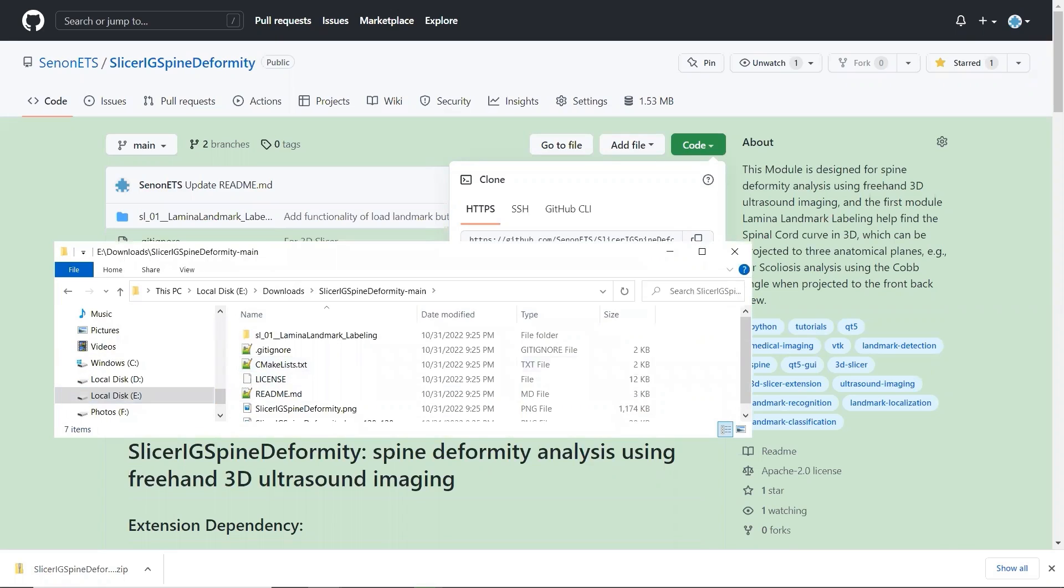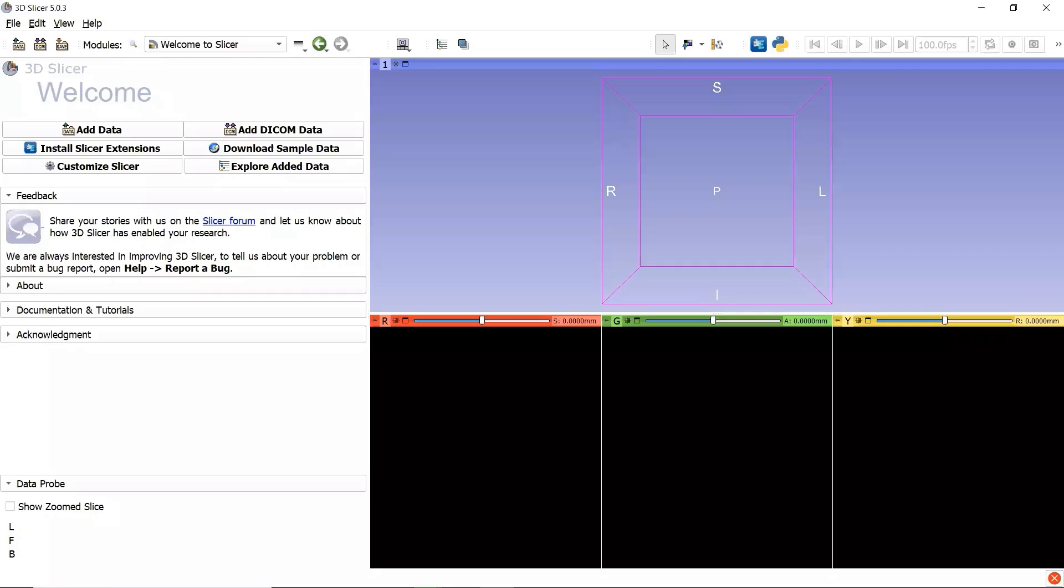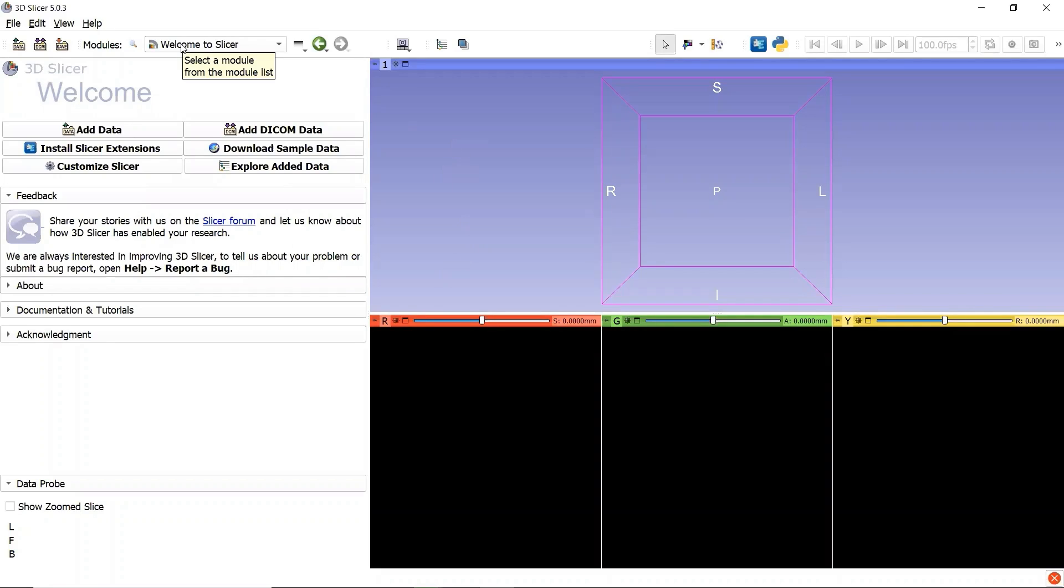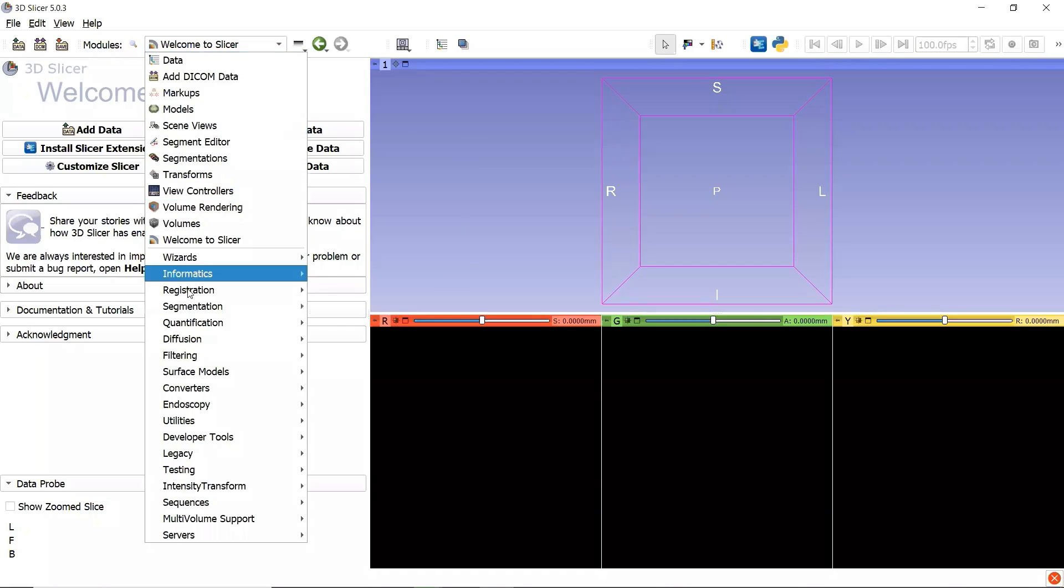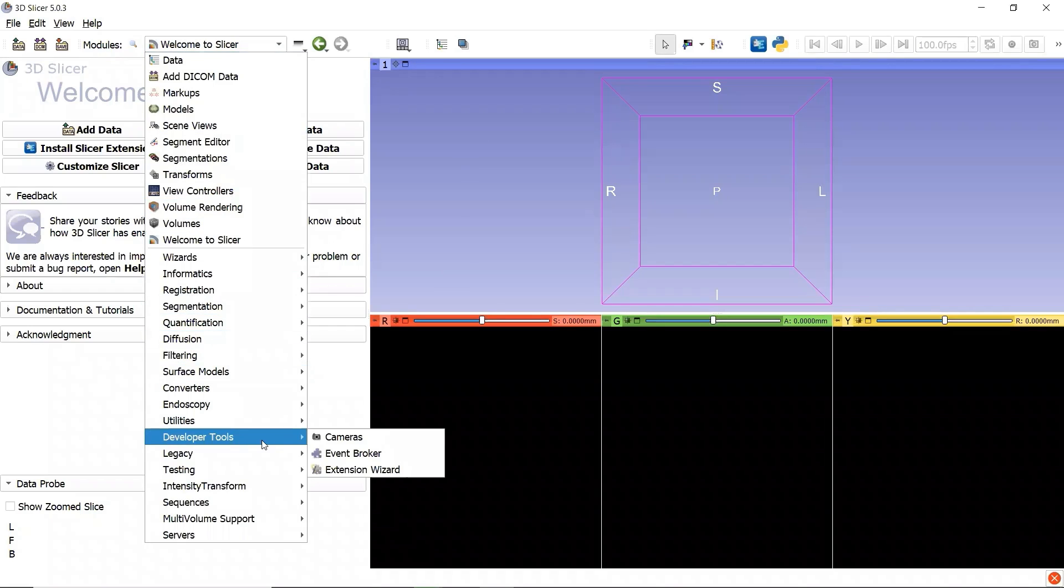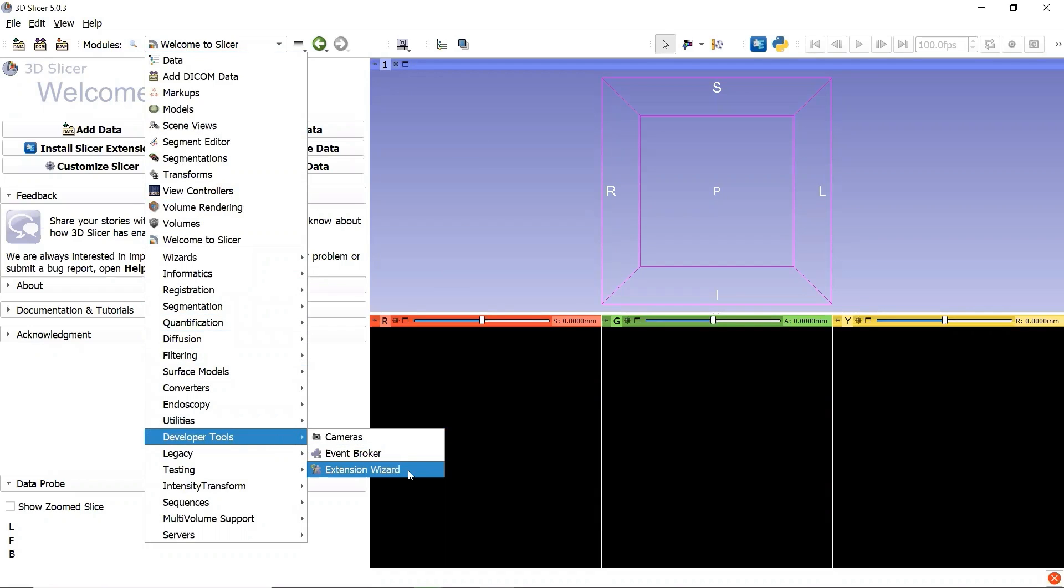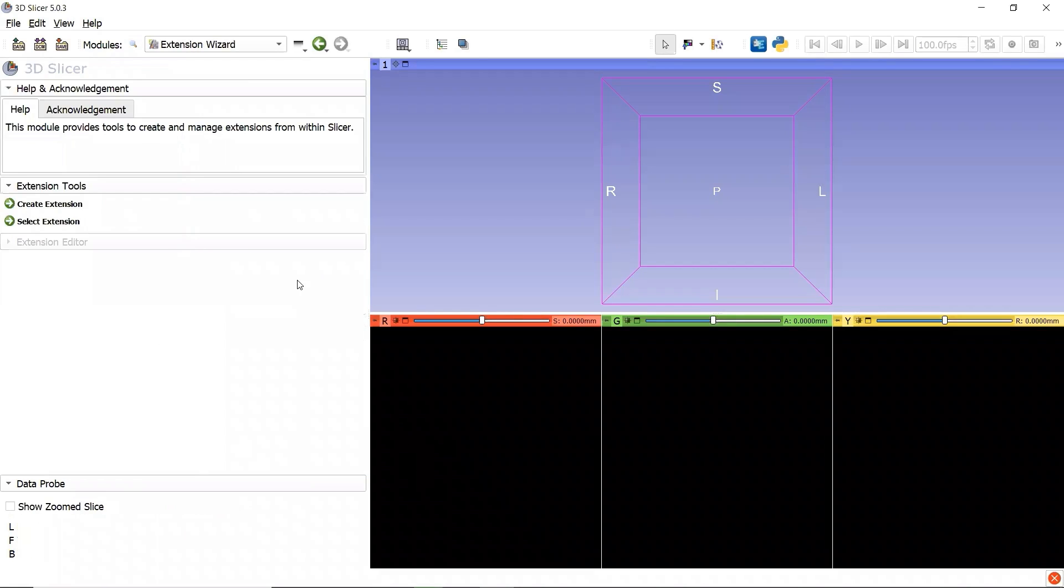Then we can install the extension in 3D Slicer. Go to the module selection, find the category Developer Tools, and click the module Extension Wizard.